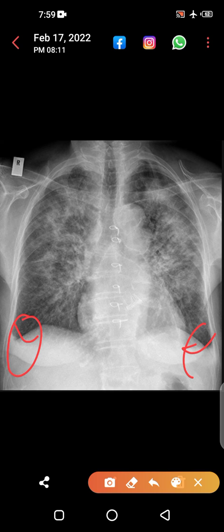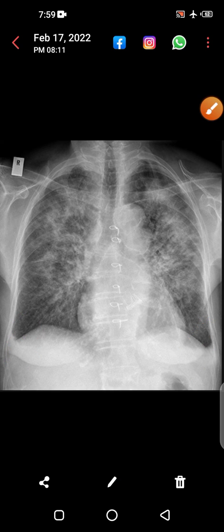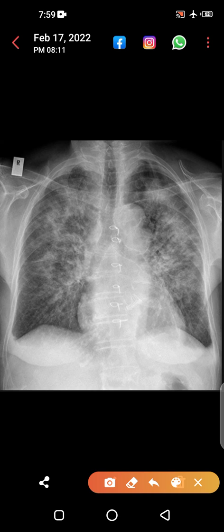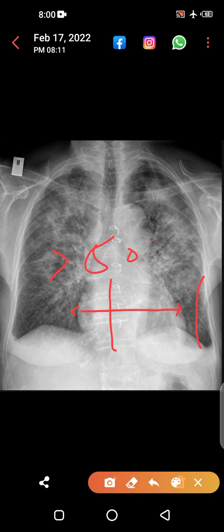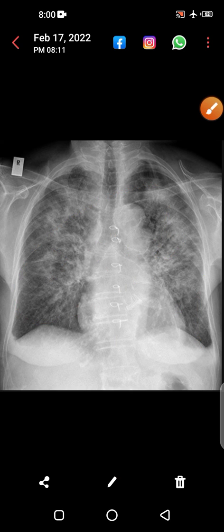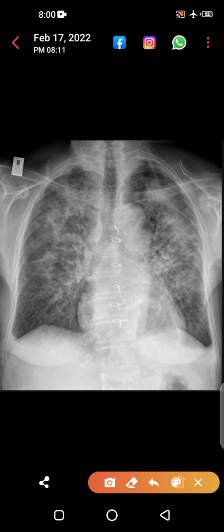The blunting of the costophrenic angle is visible. Can you appreciate the cardiomegaly? If you measure the exact size of the heart and compare it with the total transthoracic diameter, it is actually more than 50 percent — almost 60 percent. So this patient has metallic valve replacement and cardiomegaly.